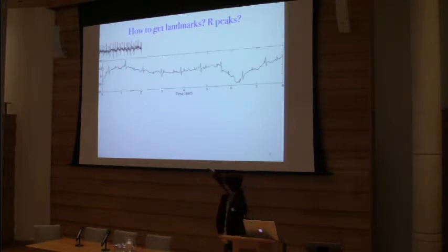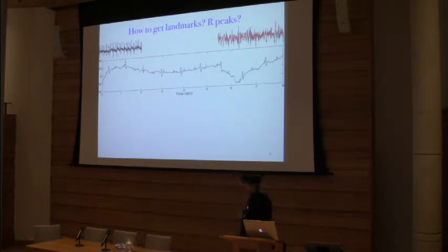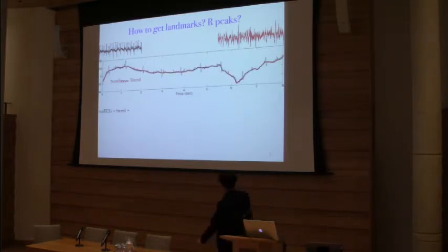How about this kind of signal? When the fetal ECG is of the same height as the maternal ECG, then this becomes challenging, right? It's not easy to determine which one is maternal, which one is fetal. And how about this one? Super noisy. Then can you really apply this traditional R peak detection algorithm? Well, you can, but I would say it's a bit challenging. I won't say it's impossible, but it's more challenging, and that is why we come to the second part of the algorithm.